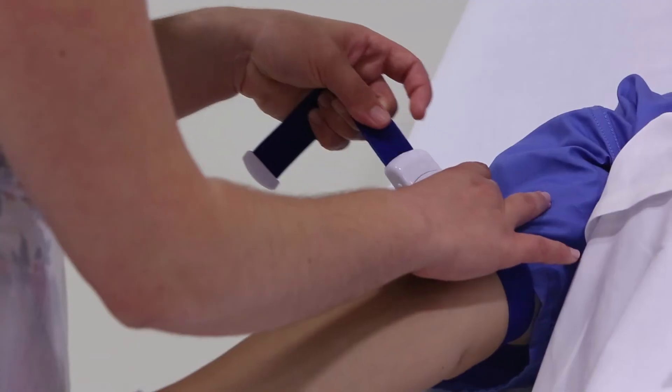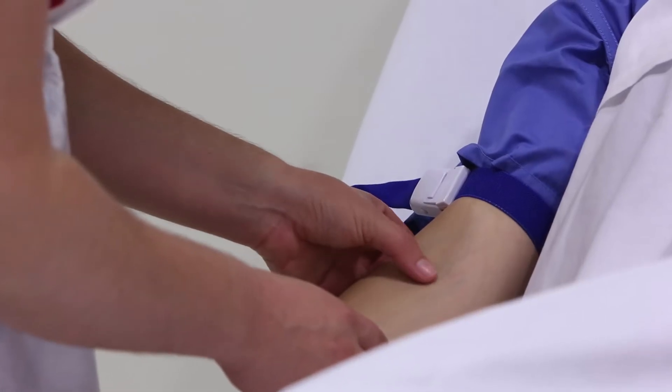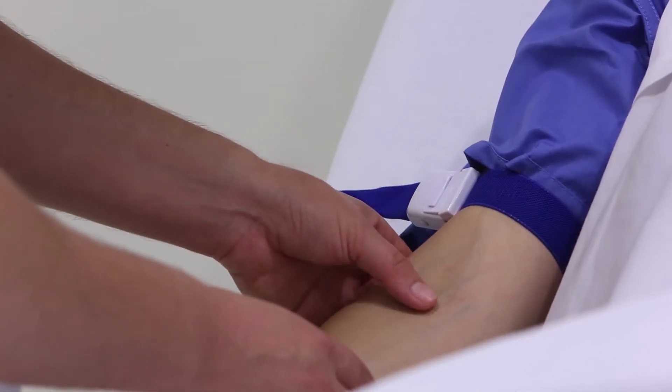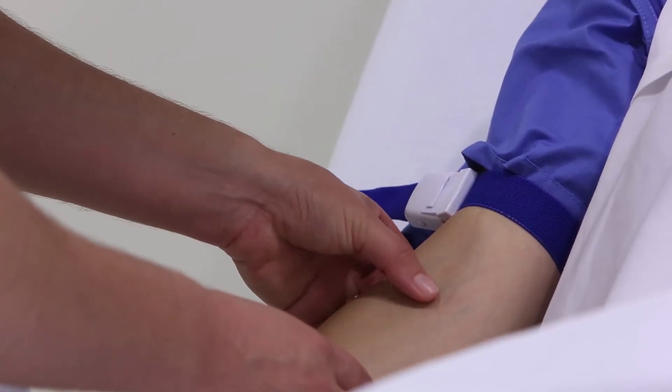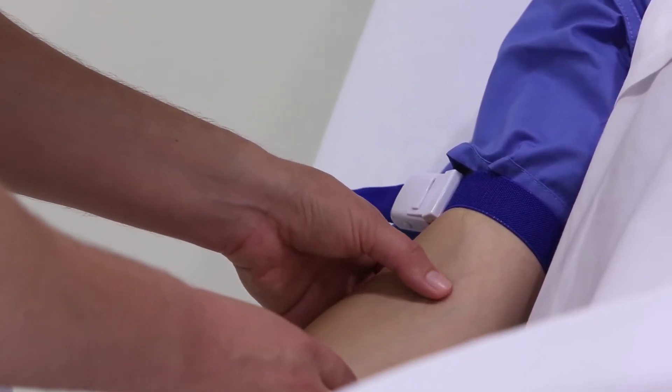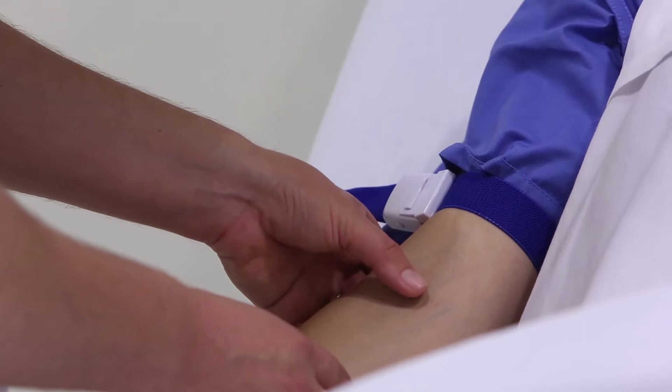Apply the tourniquet and select the venipuncture site, ideally choosing the hand veins or veins of the antecubital fossa, leaving the femoral veins as a last resort due to a higher risk of contamination when sampling from the latter. Do not use existing cannulas or sites above them.